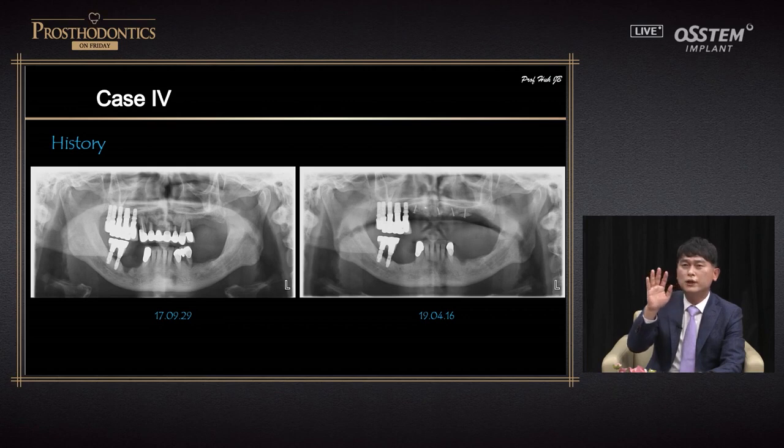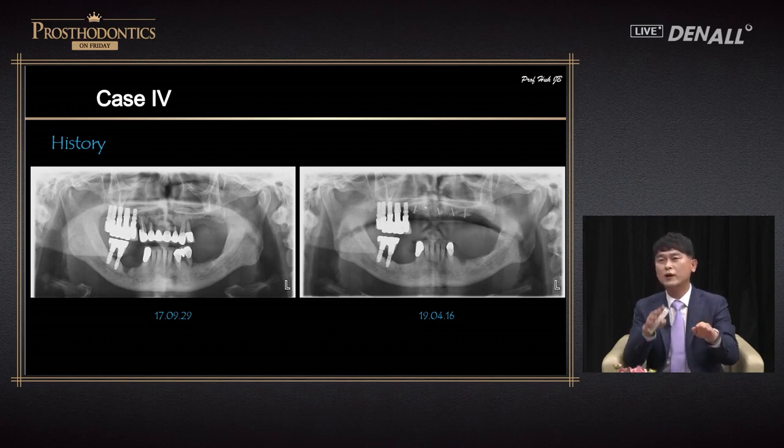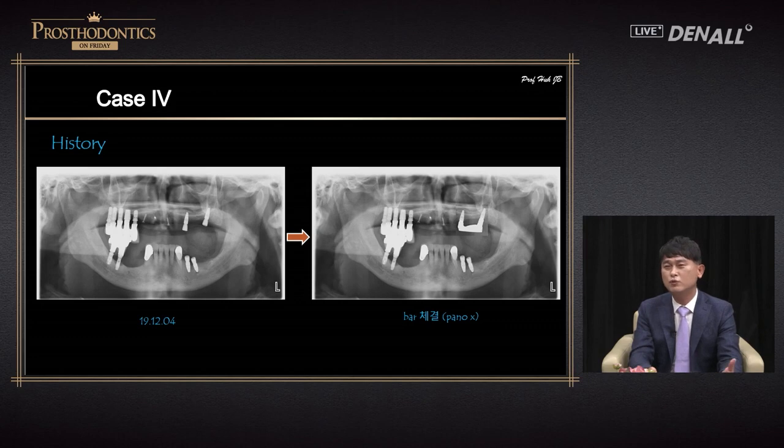Okay. In this patient, it's a little embarrassing case. We didn't place the implants on the left. September 29, 2017. Our resident extracted teeth and did block bone augmentation. The oral surgeon tried, but in terms of aesthetics and the paths, it is not very good to place implants. As the structure was the problem, I was wondering what I need to do. Our resident asked us to place 2 implants where we can.